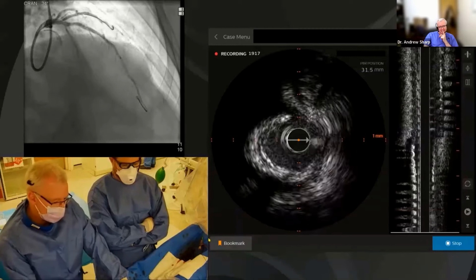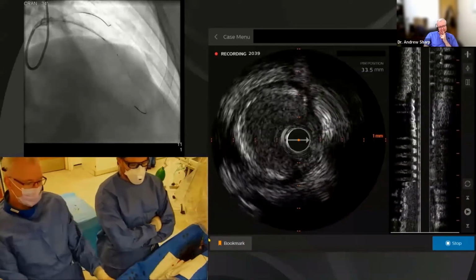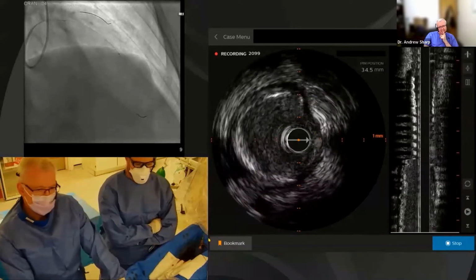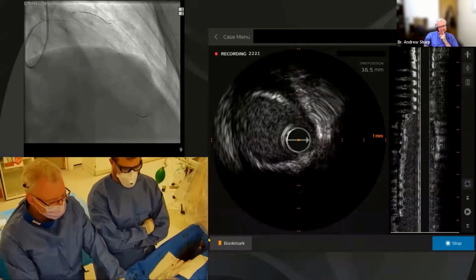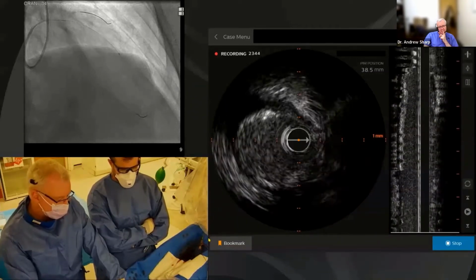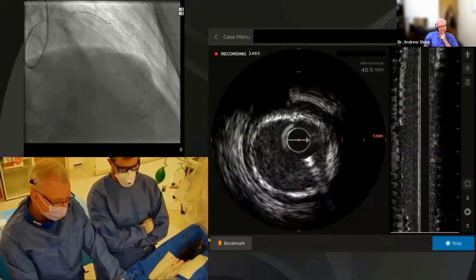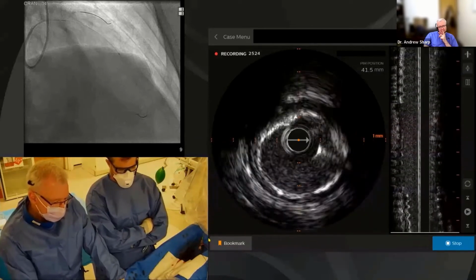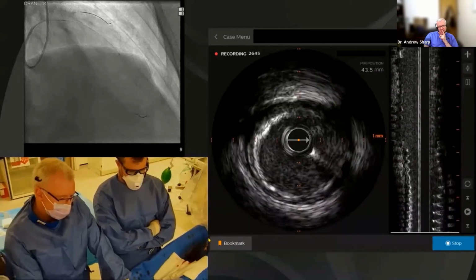And here we've got the prep segment. You can see just how much more image we're getting from the full 360-degree view, and that's because we've created gaps in the calcium for the signal to get through. And then we're coming back towards proximal. It looks a completely different vessel now, which is the goal of prep. And then we're coming back now, Prox LAD. There's the 2 wires.